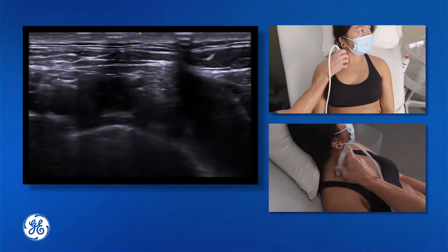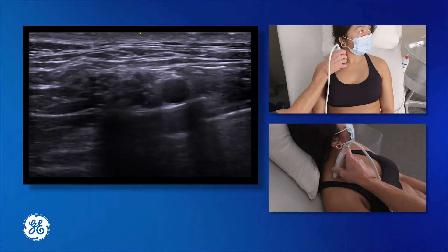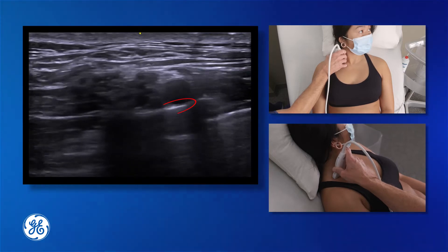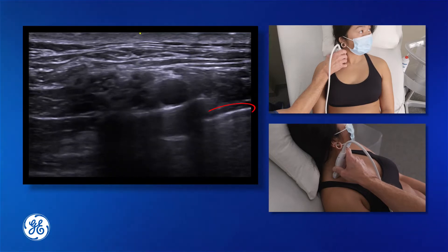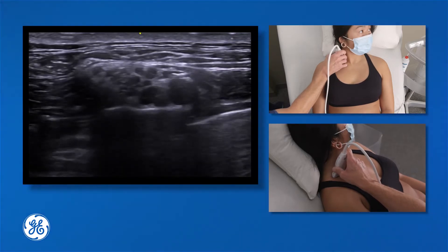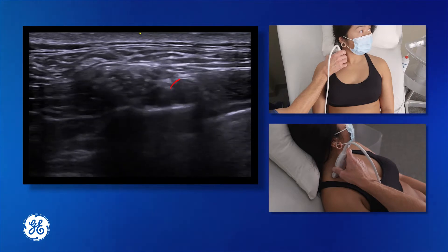If we are too anterior with our probe we are going to see our great vessels. We then need to move the probe back to find our subclavian artery and position it somewhat in the centre of the screen. Below the artery we see the hyperechoic band of the first rib. On the medial side of the artery, which is on the right side of the screen, we can see the pleura clearly. A little lateral tilt on the probe gives us a great view of the hyperechoic bundles of the supraclavicular plexus sitting on the lateral side of that artery.